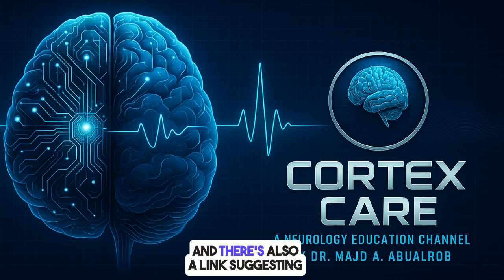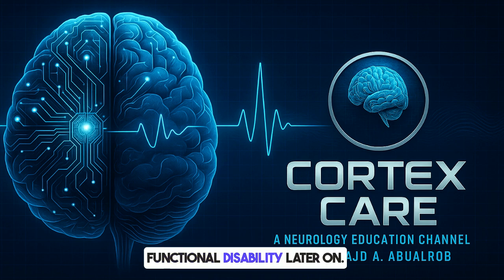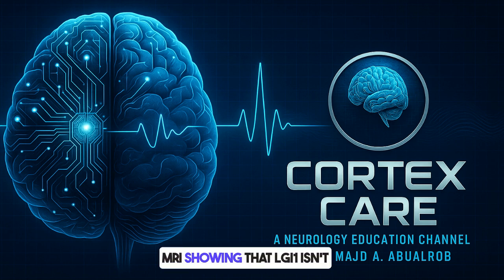That makes sense. And there's also a link suggesting that having those initial bright spots, the hyperintensities in the temporal lobes during the acute phase, is associated with greater functional disability later on. Okay. So initial changes might matter for long-term function. What about advanced MRI in LGI1? Does it show more? Yeah, similar to NMDAR, advanced MRI shows that LGI1 isn't just a limbic system disease.